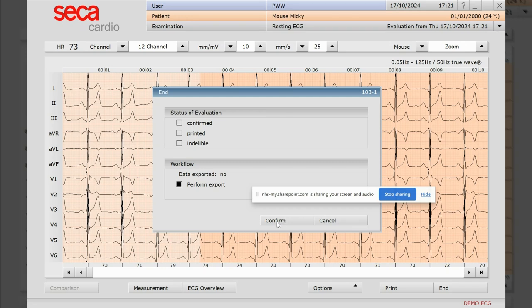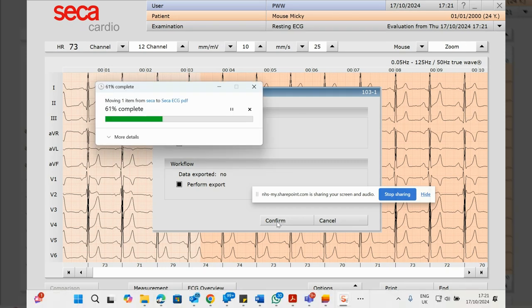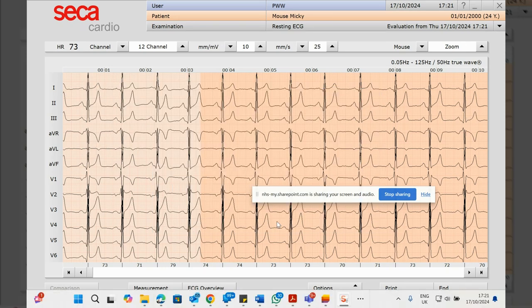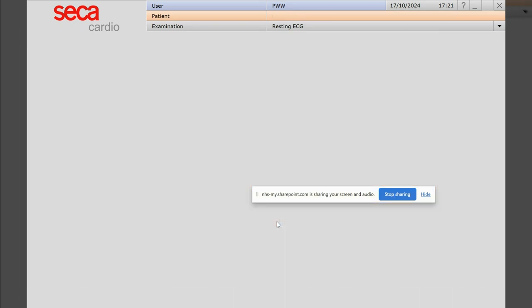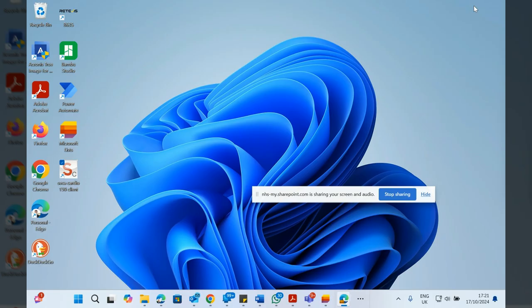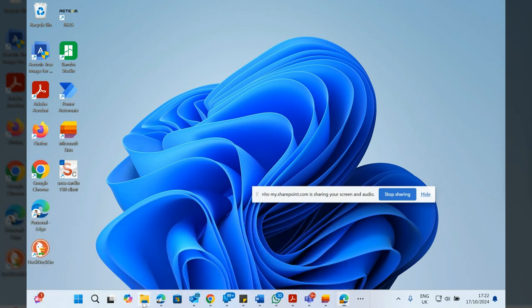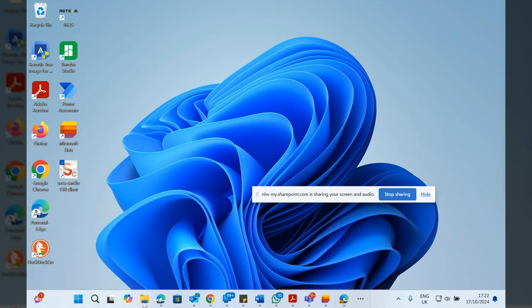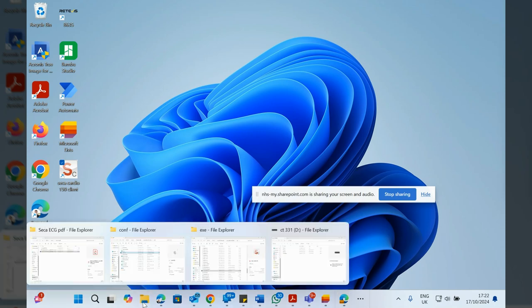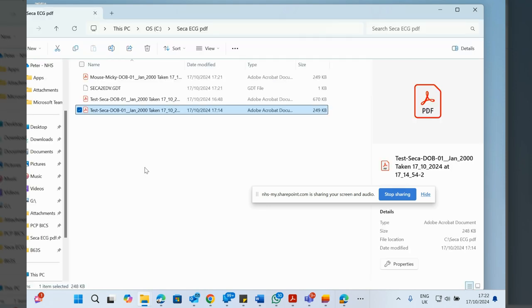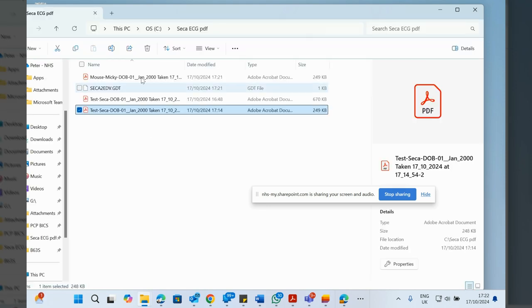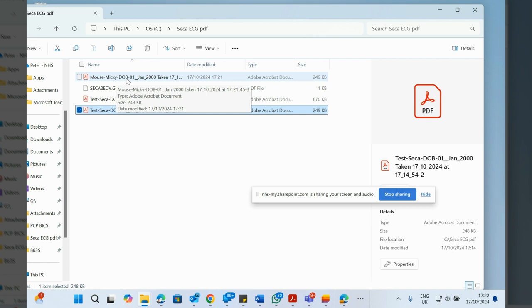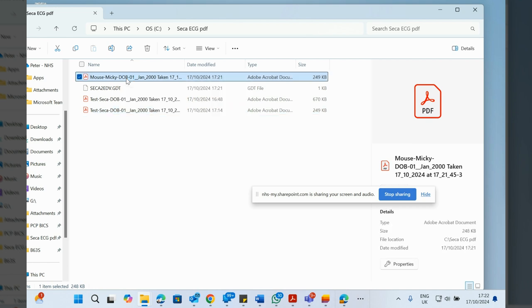And what that will do is export it to a PDF file. Brilliant, so if I just come out of there and go into my file explorer, we'll see there's a Mickey Mouse ECG up here on the top. I'll double click that.